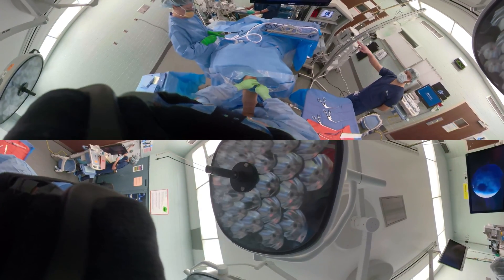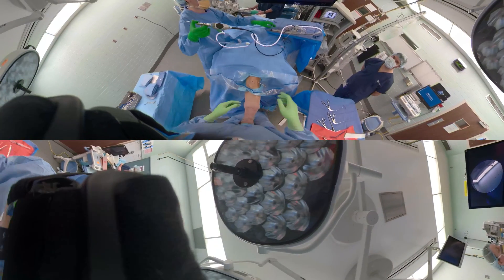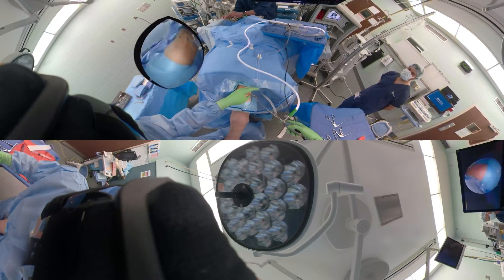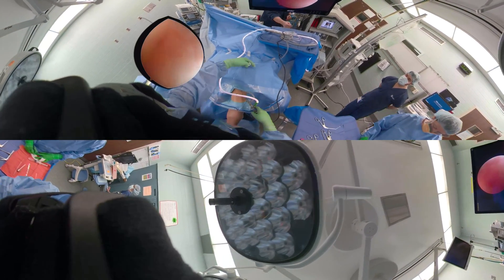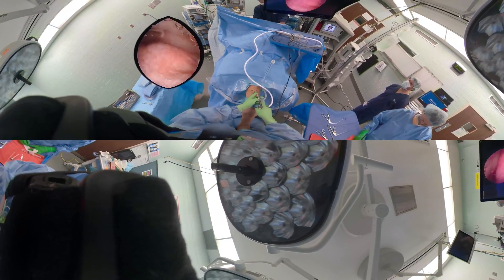Now we'll get the 30-degree arthroscope. You can see the light source — the light goes 30 degrees opposite of where the light cord is. Turn the water on. The water has to be on at the base of the camera as well as what was just opened up.